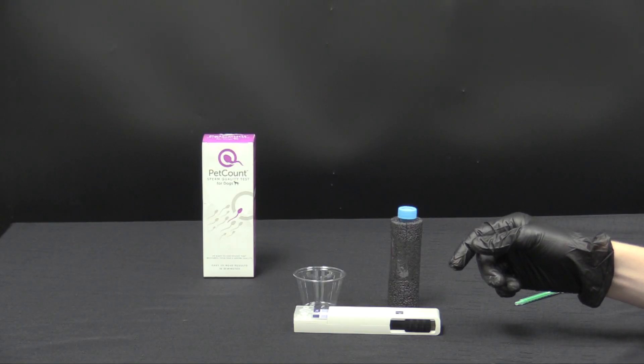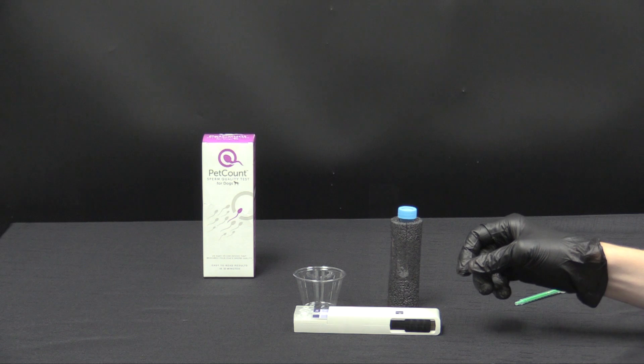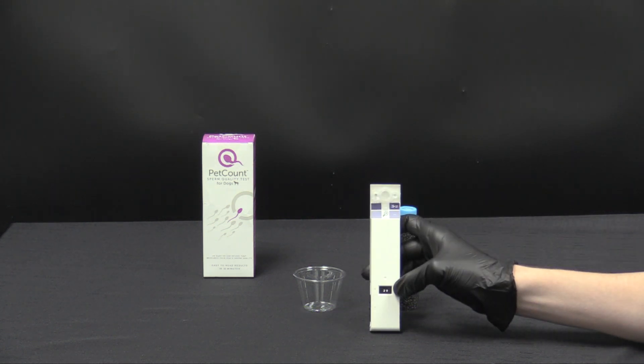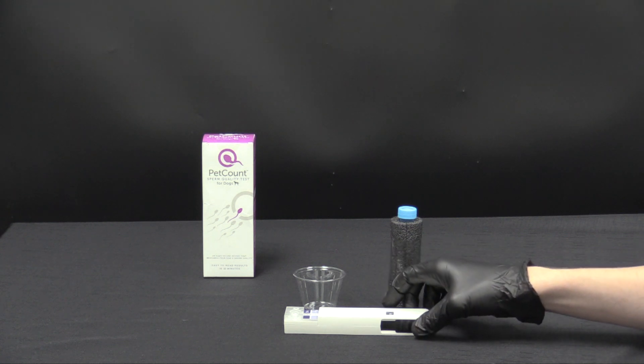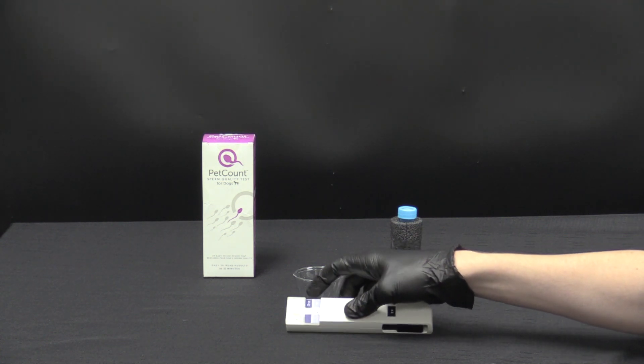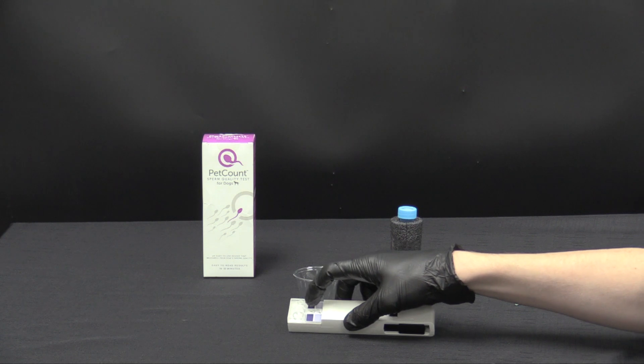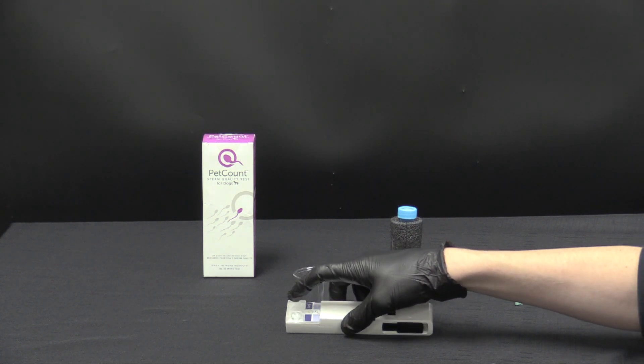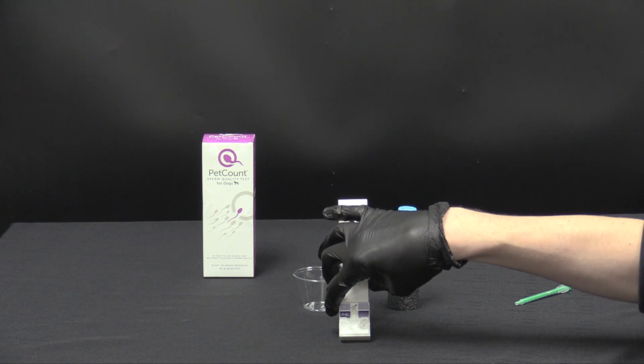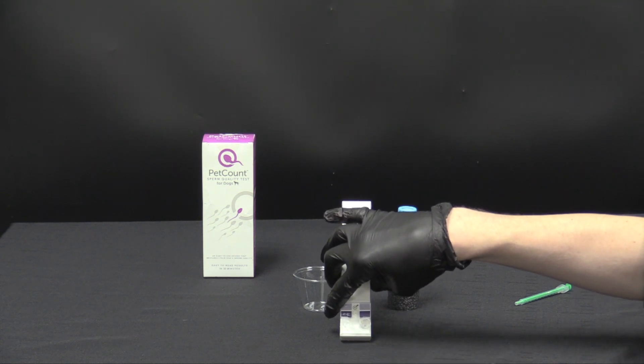First we'll take a look at the test cartridge and some of the components and features of it. You'll notice the number two with an arrow on the slider here. Please don't adjust the slider until we're ready to test. And on the front we'll notice the viewing window, the sample depositing well, and on the plastic if you look close you can see a syringe and the number one next to the depositing well.